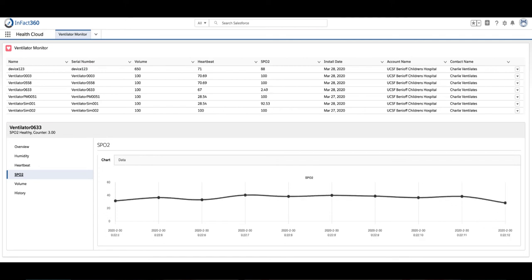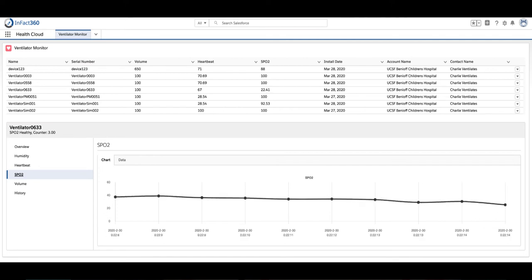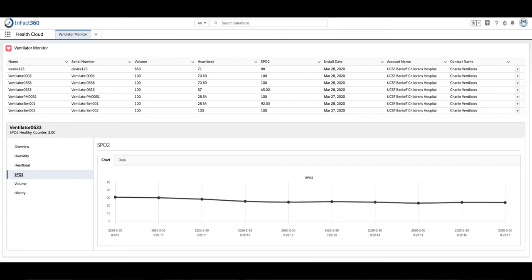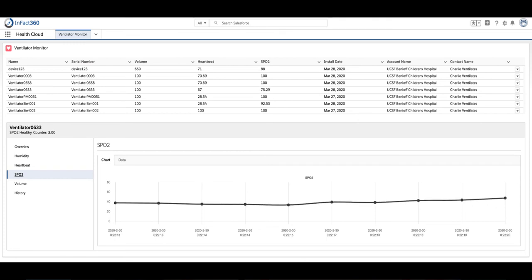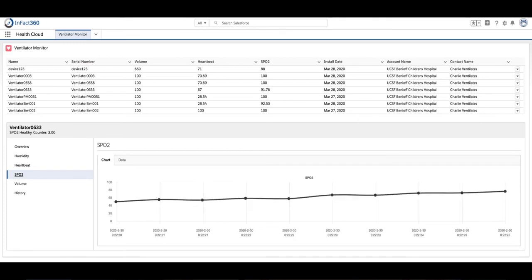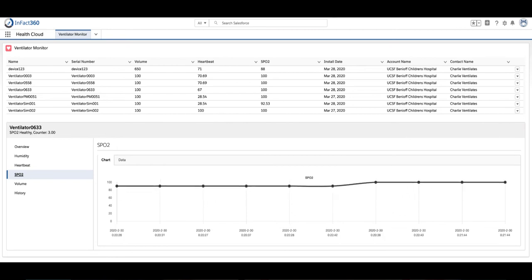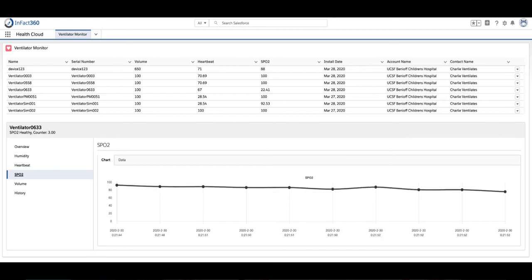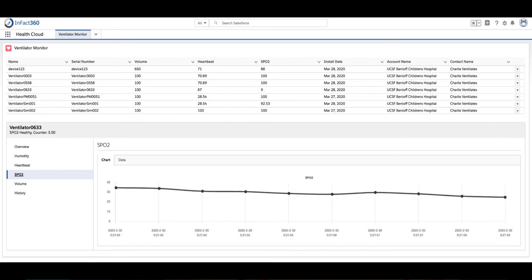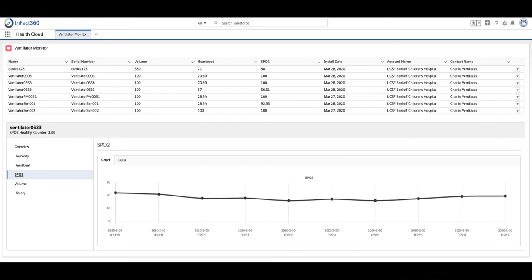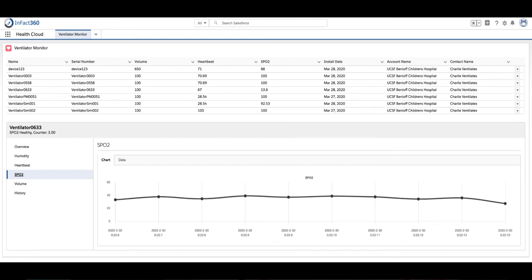This dashboard is a Salesforce lightning component and provides visibility into all the ventilators at this location. At a glance, you can see all the machine and patient metrics and drill down into a specific measurement, like in this case, SPO2.